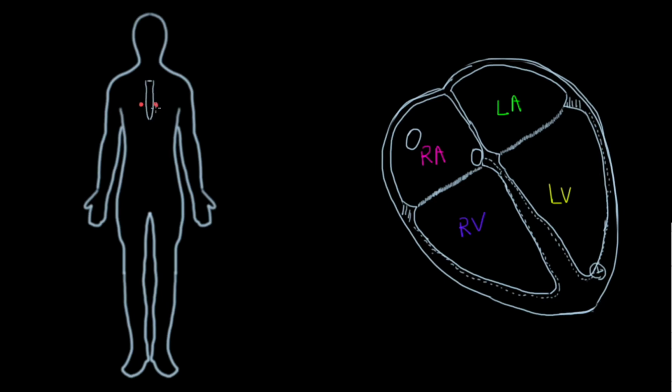Left side of the sternum, there's a V1, V2, V3, V4, roughly speaking, V5, V6, and it kind of wraps around the body. And what that does is create, again, a vector space similar to what we had before, except it's a little bit harder to draw, but it's coming from inside the body out towards you, or out towards the surface of the person's body.